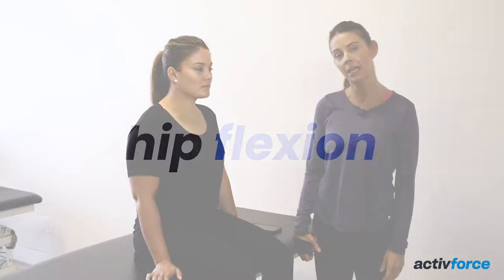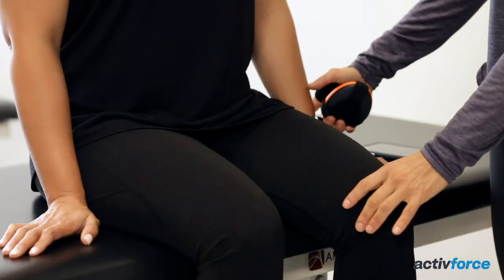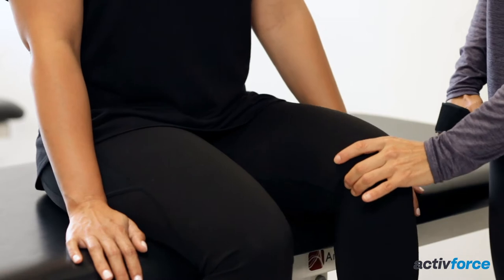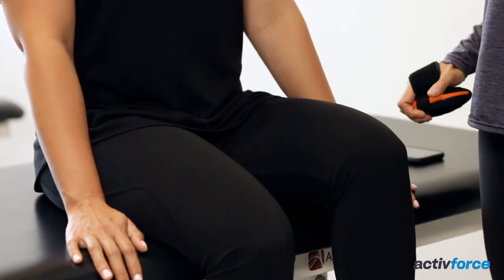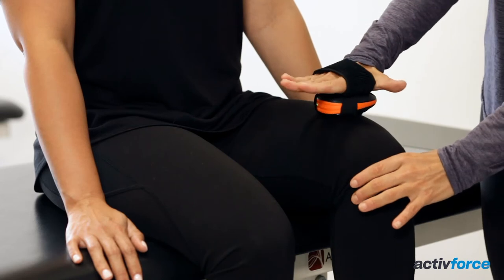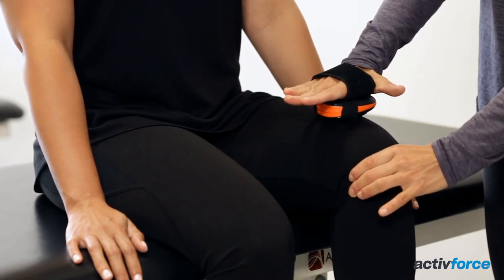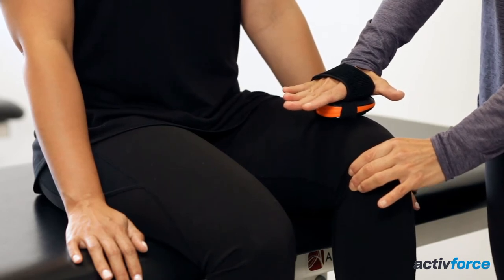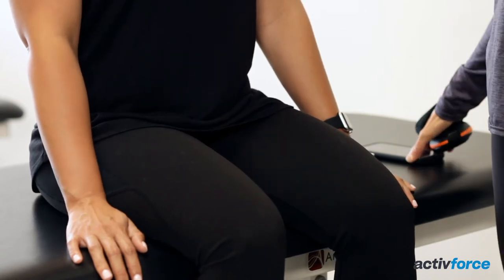After creating the client profile in the Active Force app to test hip flexion, have the client seated and hold on to the table. Slightly flex at the hip. Press Start on the Active Force app. Place the Active 5 on the distal femur. Have the client squeeze up into the Active 5 for 5 seconds, then relax. Press Save on the Active Force app.